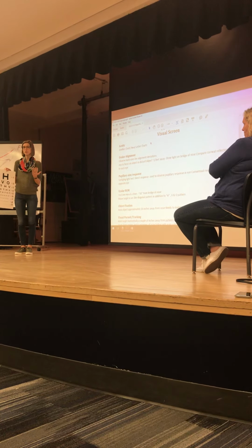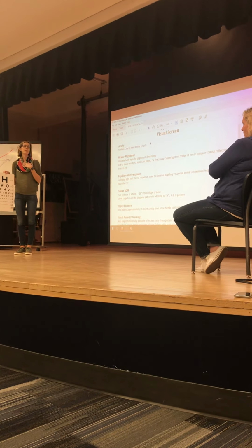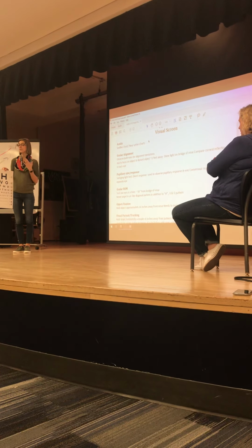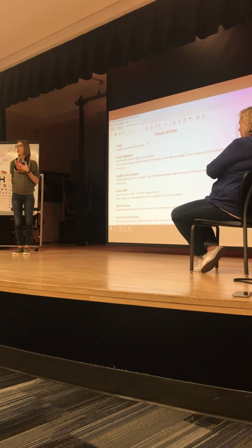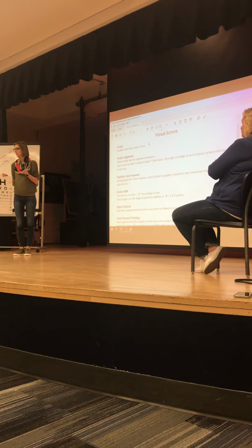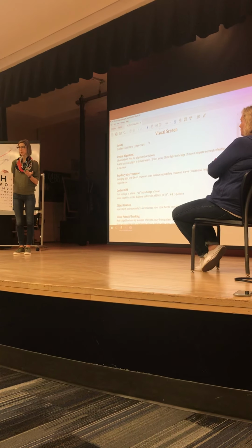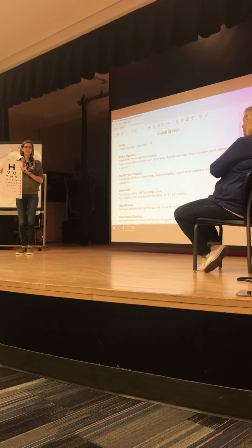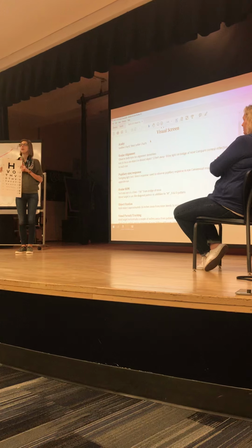I will do both. For the purpose of today, we're going to be looking at distance vision, but there are also near or reading vision charts that occupational therapists commonly use because they give us a more functional sense. Like I talked about earlier, what I'm concerned about is their ability to read medication labels, read the instructions, read their home exercise program. What we're doing right now is using the Snellen chart to do a general acuity evaluation.